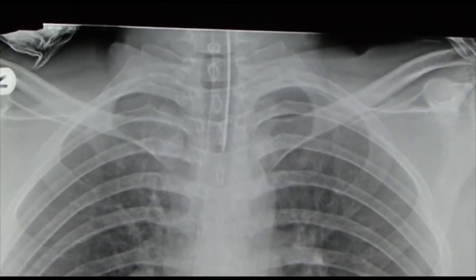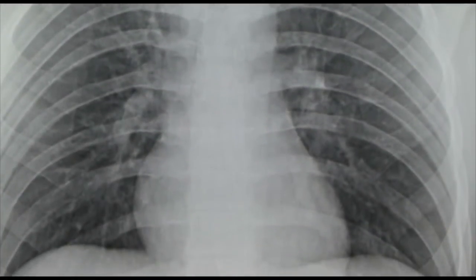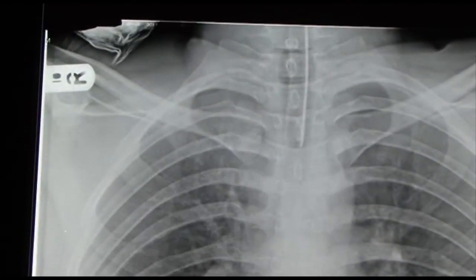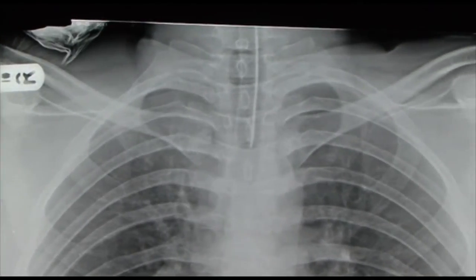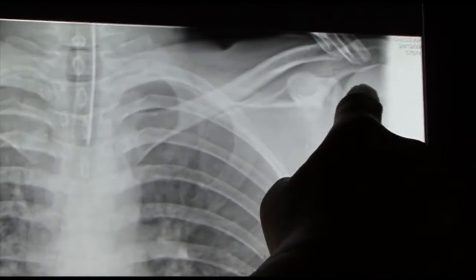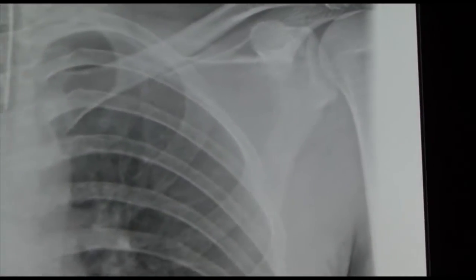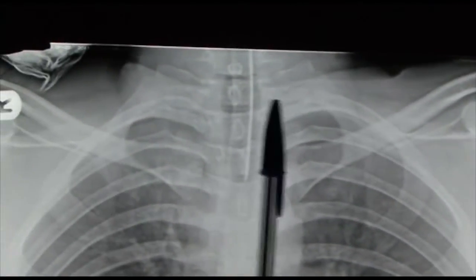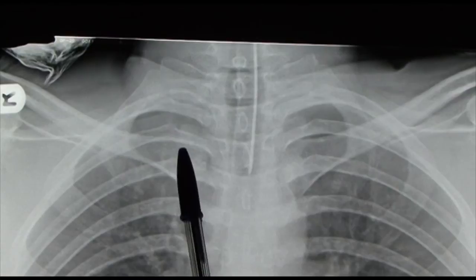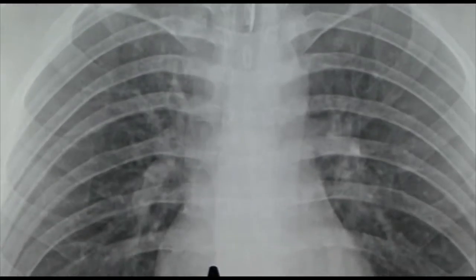Here we can see the vertebrae going down, we can see the clavicle — the collarbone — and behind that we can see the scapula, and there we can just see the head of the humerus on the left side. Now the first rib is curly, so that's the first rib there, and on that side you can see it going round: rib number two, three, four, five, six, seven, eight, nine, and ten.